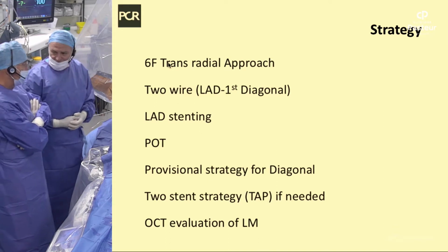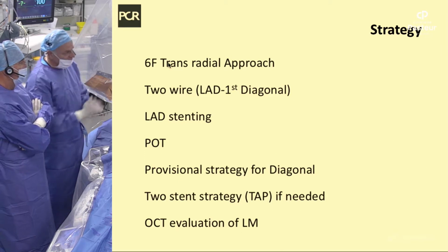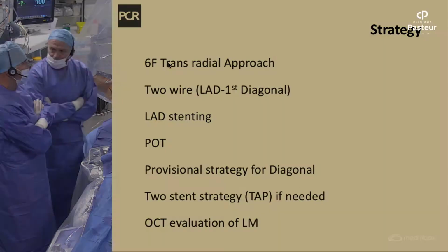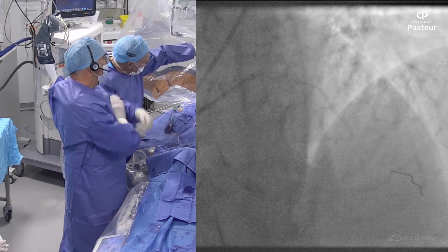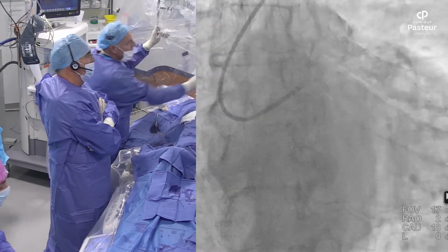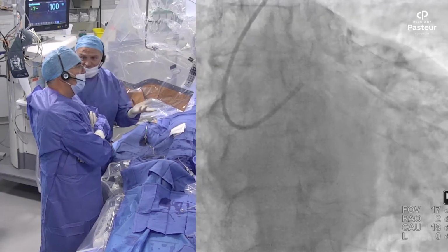But probably now we can review the angiography and show our colleagues what this lesion looks like. You can show us the previous view, and you will see on the previous view the image on the left main in particular. Here we see it's heterogeneous at the level of the left main.